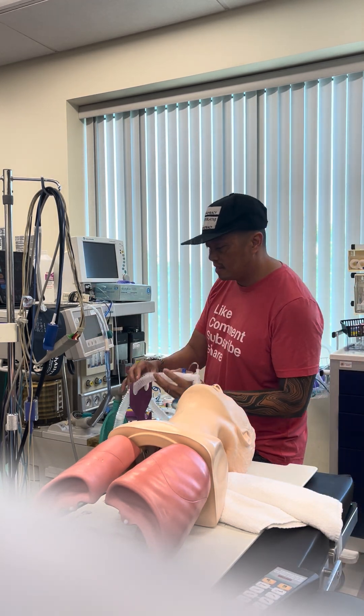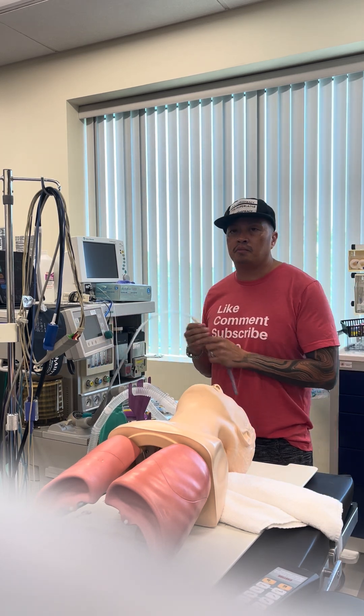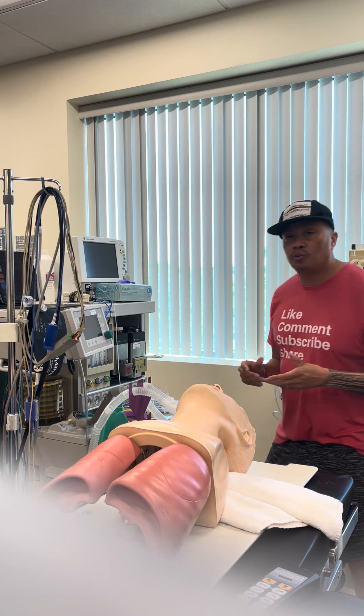There she is. And then I'm going to start SAMTIDE — S is for suction. I'll make sure that my suction machine is installed, it's on, ready to go. And I'll start with airway.